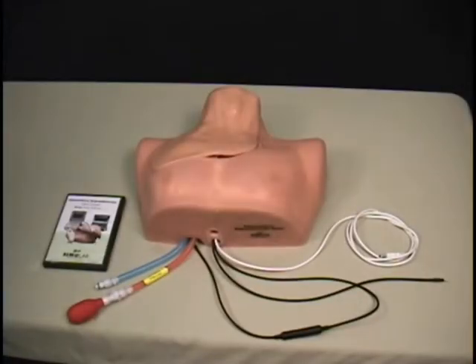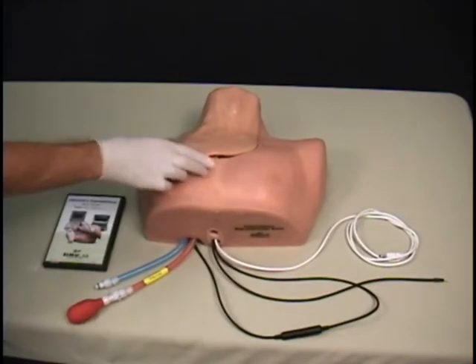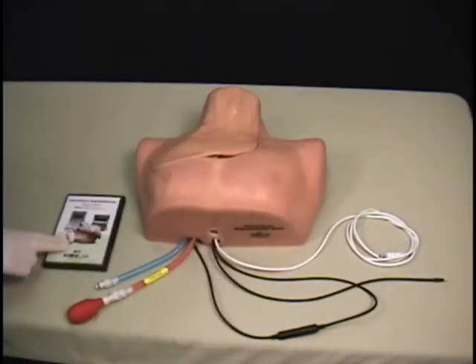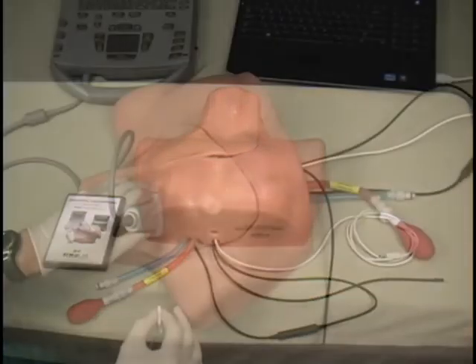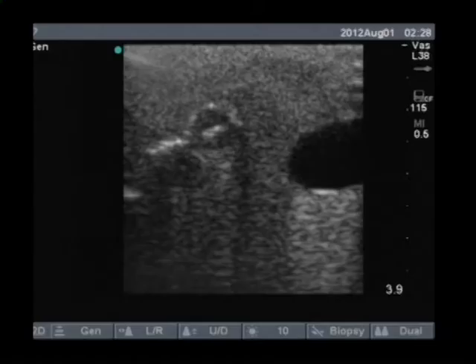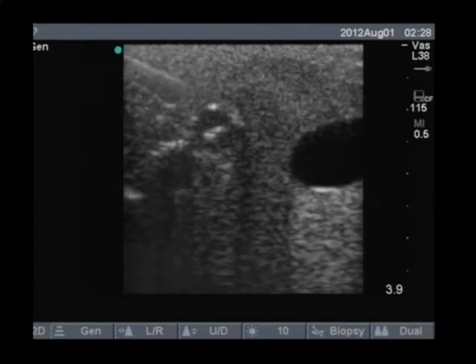The system includes a body form with a replaceable smart tissue, nerve stimulator electronics, and smart tissue software. The tissue responds to ultrasound imaging for needle guidance and feels like human tissue, and yet it is ultra-durable for repeated use.